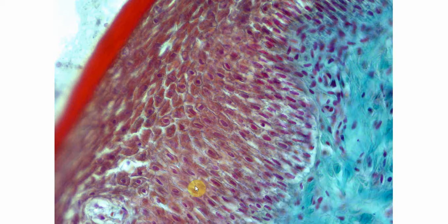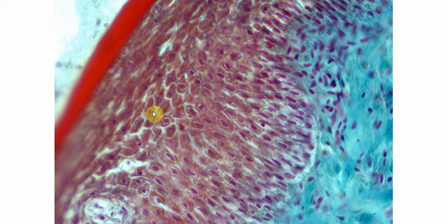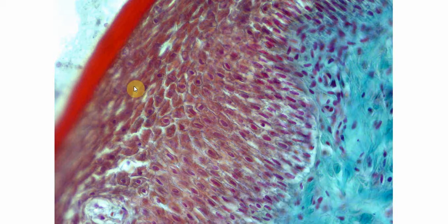The next layer is the granular cell layer because keratohyaline granules are present in these cells. We call this the granular layer. In this slide, the granules are not very clearly visible. The granular cell layer cells are flattened in shape — you can see they have a fusiform shape. It is also several layers thick.